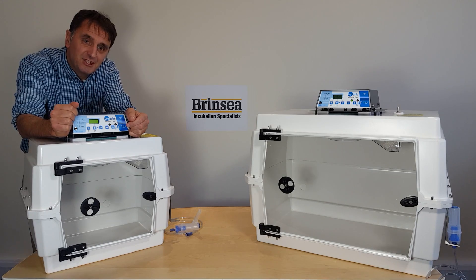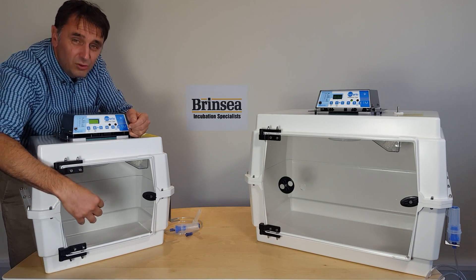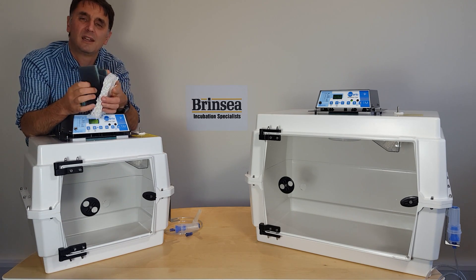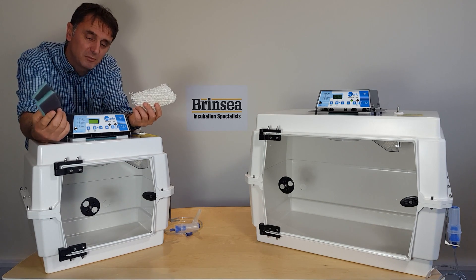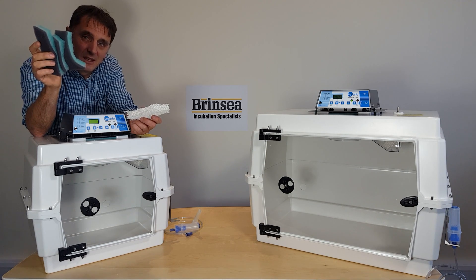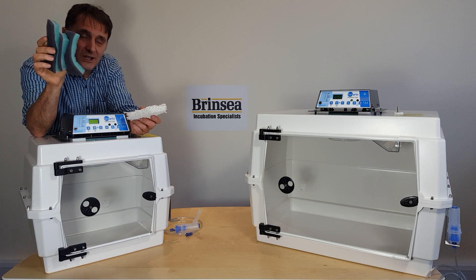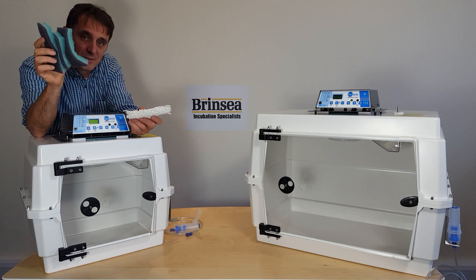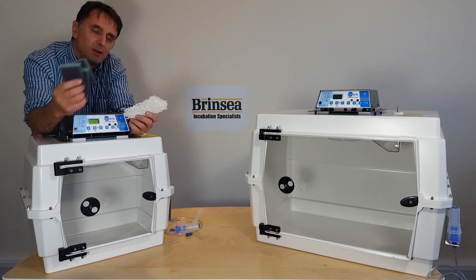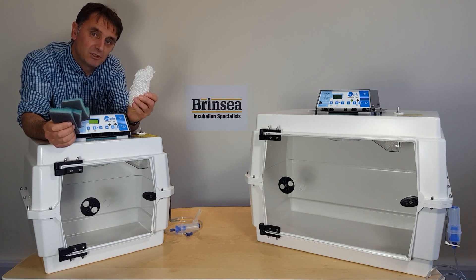The rate of fresh air exchange can be adjusted with the vent control mounted on the door. Replacement filter sets and evaporating blocks are available. Filters should be checked after each use of the unit, and if dirty, hand washed in warm water and allowed to dry before replacing them. Replace those filters every six months or so. Evaporating blocks need to be more regularly replaced if you are using them.